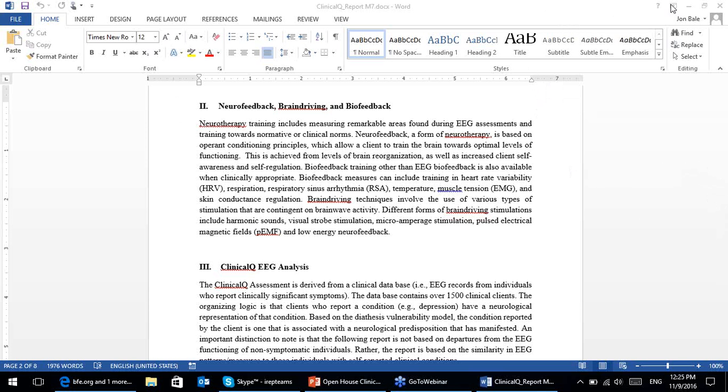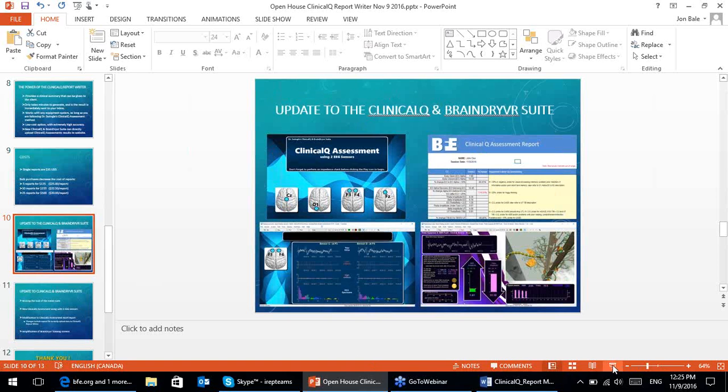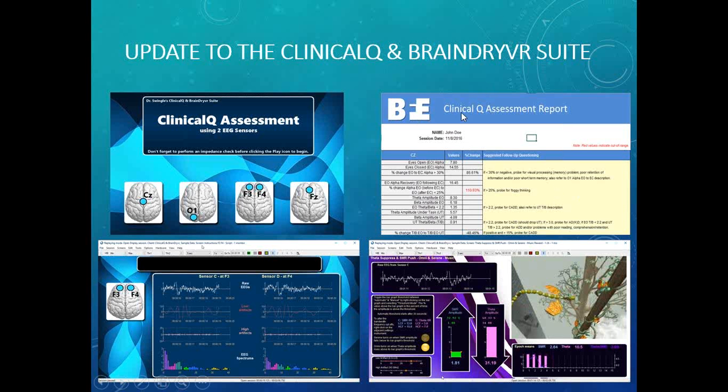All right, so moving on, let's look at the new ClinicalQ and BrainDryvr suite updates. I'm excited about this update because we've had a chance to look at a few things. Just so you know, the update is not out as of today. We will be releasing it in about 2 weeks, and everyone who has previously purchased the BFE's ClinicalQ and BrainDryvr suite will be notified by email.